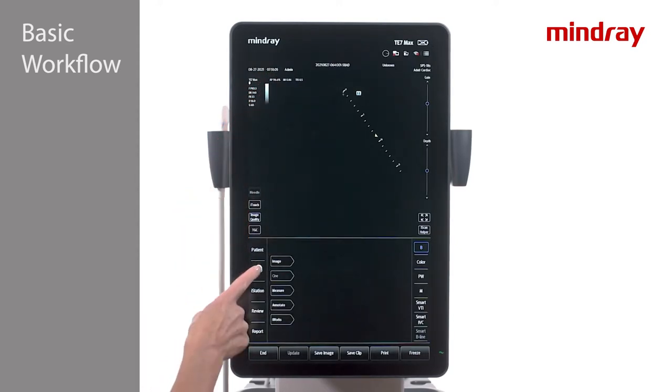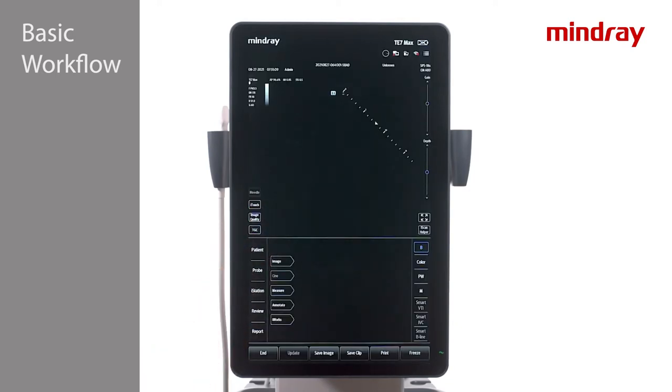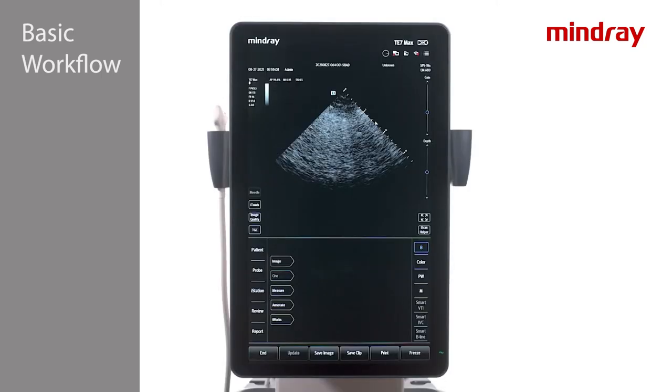Return to the Probe tab at any time during scanning to change exam modes or transducers, or to reset imaging parameters if needed. Now the system is ready to scan.